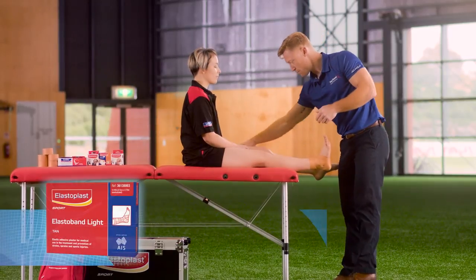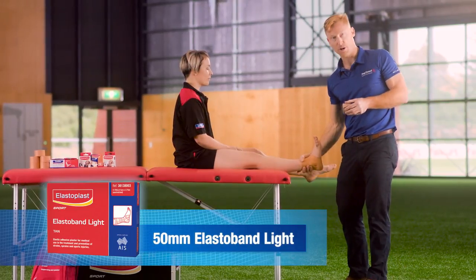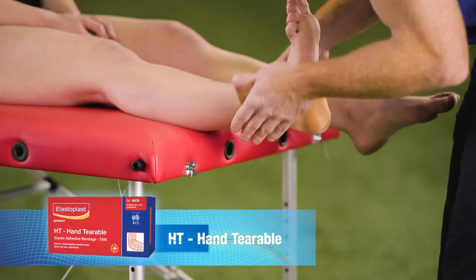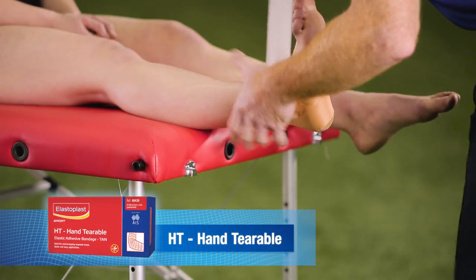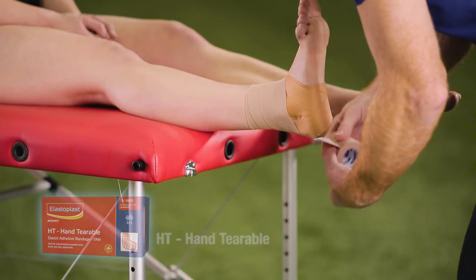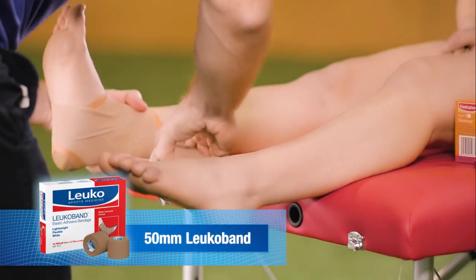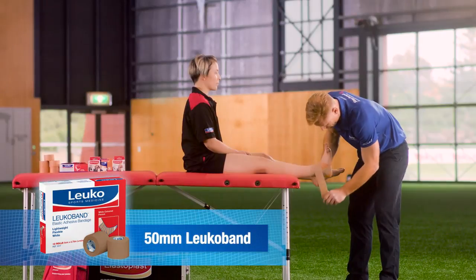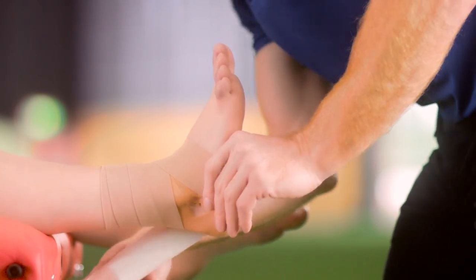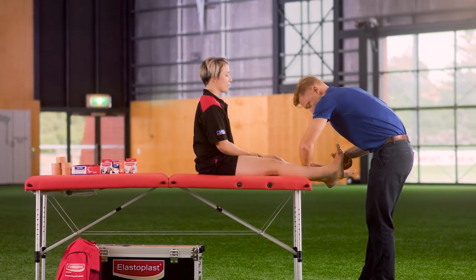In a more acute situation, we can also use Elastoplast adhesive bandage 50mm to aid compression to the area and assist with reduction of swelling and inflammation. We make sure we start superiorly or above the ankle, covering all the rigid tape, flowing in a figure eight direction, finishing at the inside of the ankle.